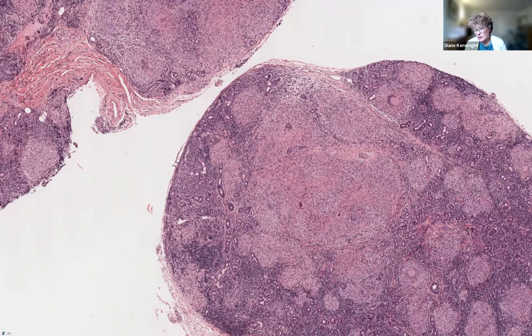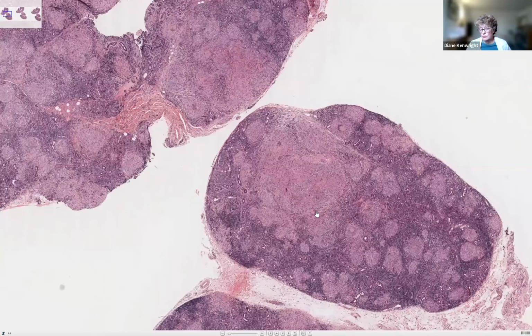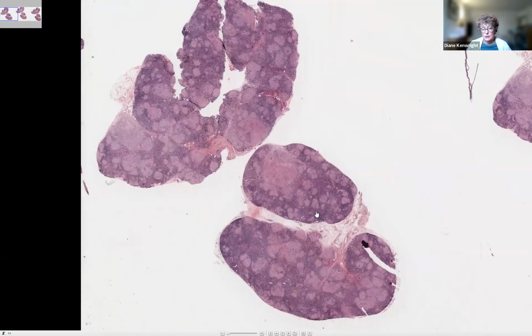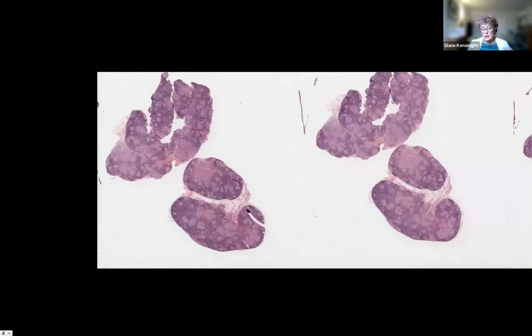It's going to be so incredibly rare to get TB in the lacrimal gland, but maybe some people with Crohn's disease might get some lacrimal gland granulomas. And then in order to sort it out, I would recommend not doing a raft of stains, but doing some clinical correlation. So if the person's got known sarcoidosis and it looks like this, then you're going to call it sarcoidosis.